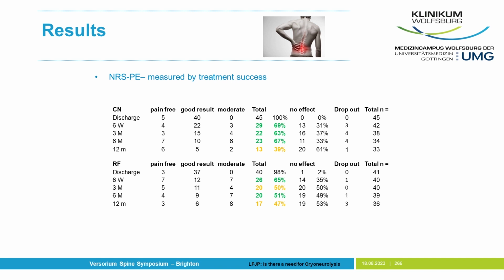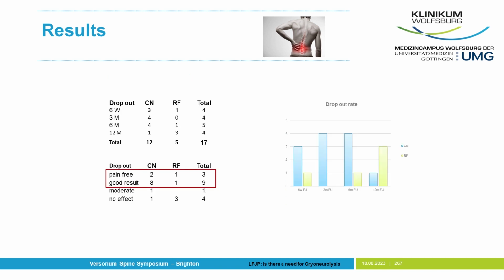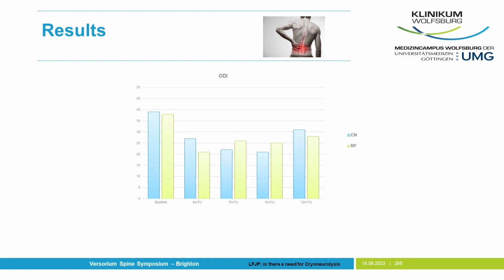We had a high dropout rate. That's not so good, but when you look for the dropout, we had a lot of patients who were either pain-free or had good results when they left. The improvement of the life quality was better until the 6 months. There were a little bit differences between the cryo and the RF, even for the Roland and Morris.